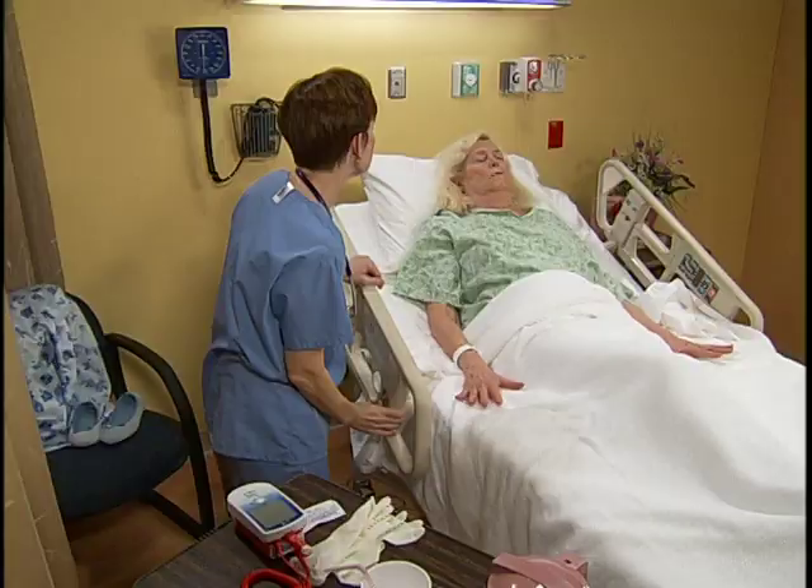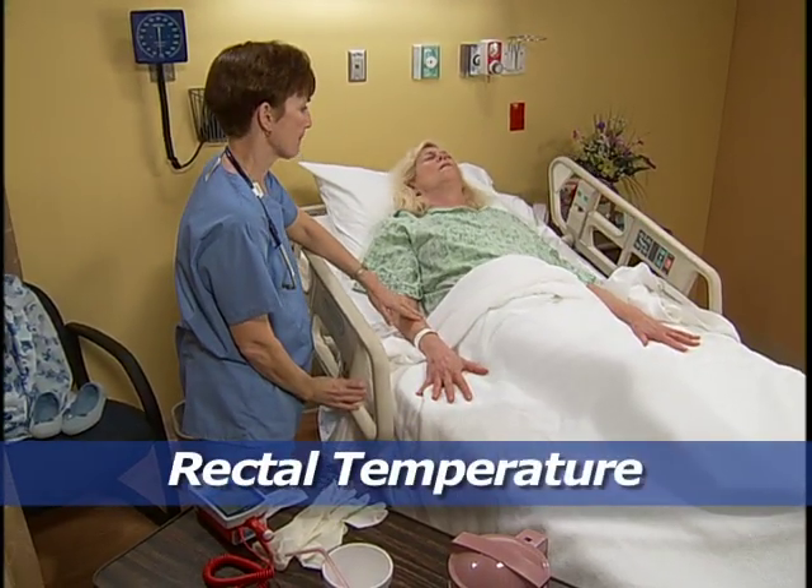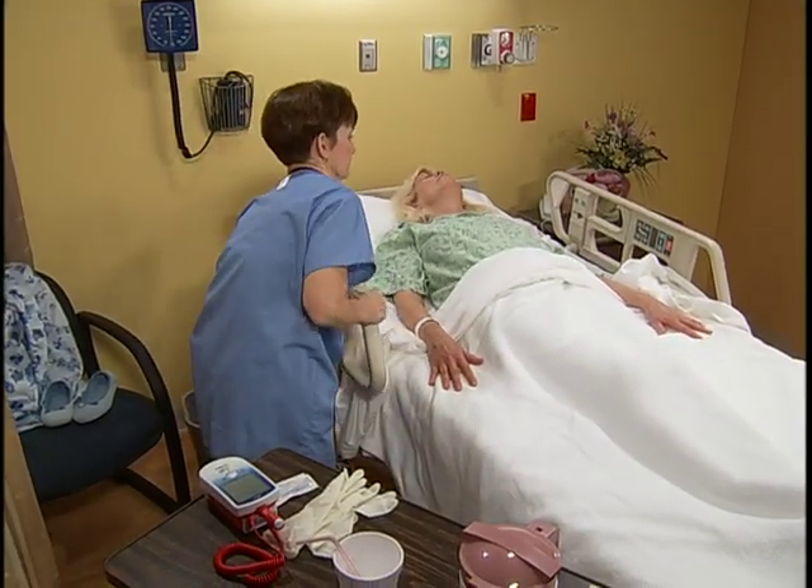This is fair and we're going to take a rectal temperature this morning, okay? For a rectal temperature, ensure the patient's privacy and help her into a side-lying SIMS position with her upper leg flexed.